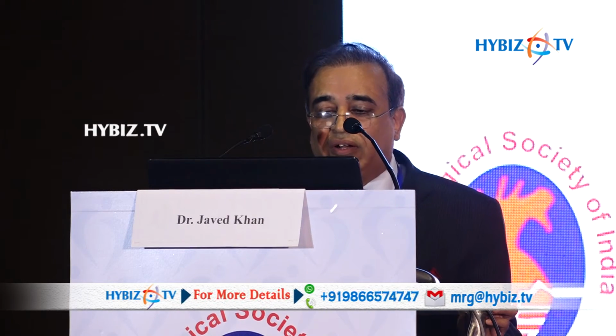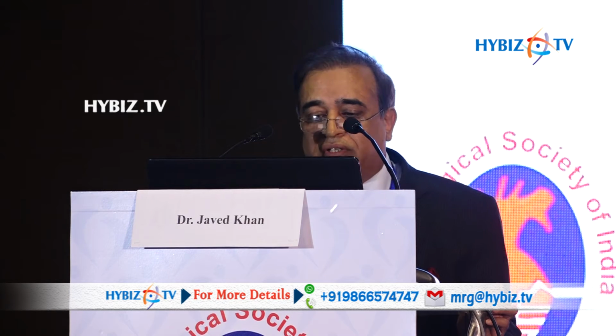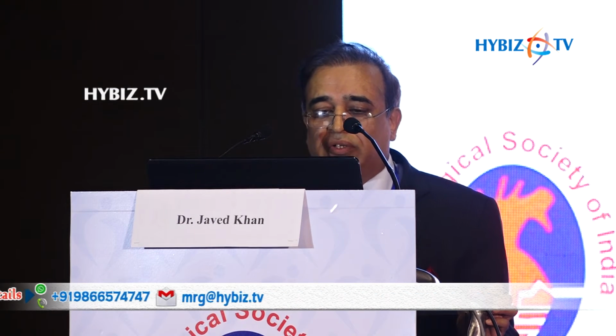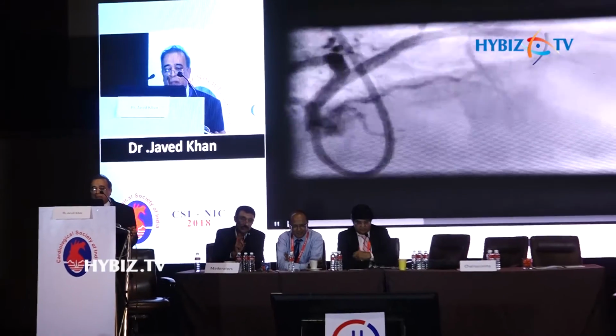The wire is slightly in a small vessel, distally in the LAD, slightly in the diagonal. We did not worry about this because the procedure was completely asymptomatic and uneventful.